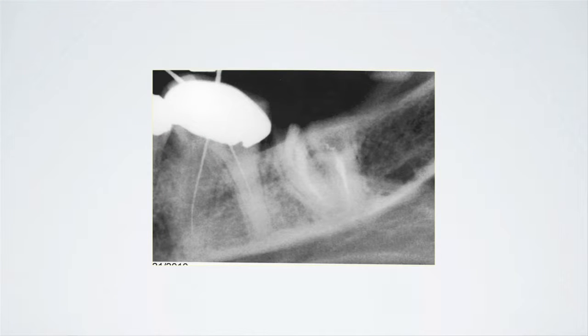Let's move on. Talk about the rubber dam. We all should be using that. We have to be using that. An illustrated case for you here of this nice case that was started here.